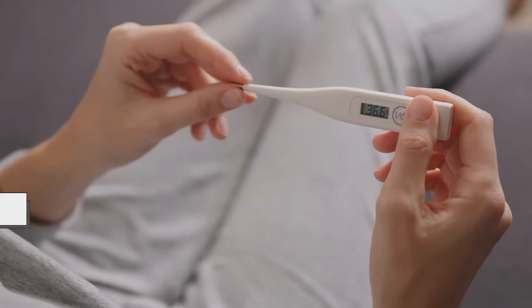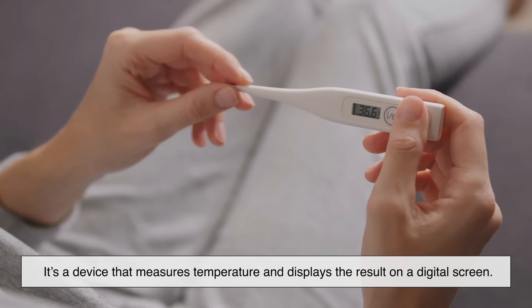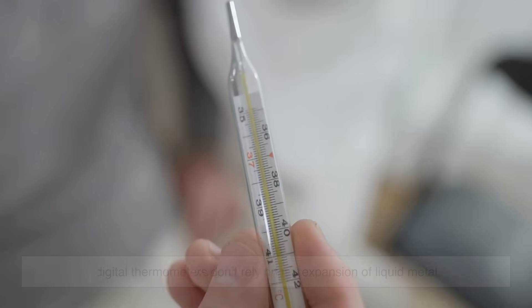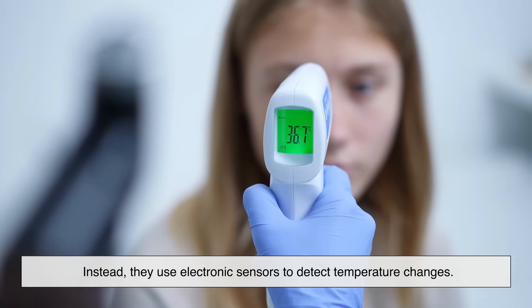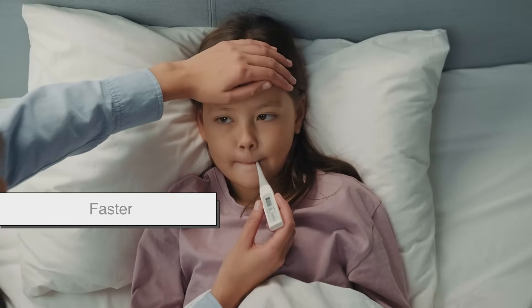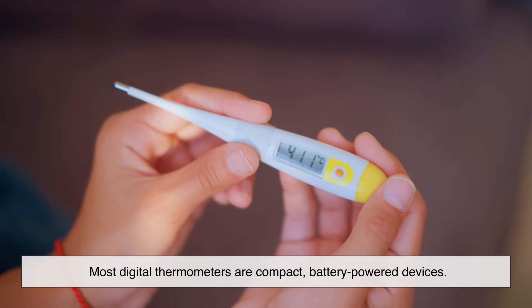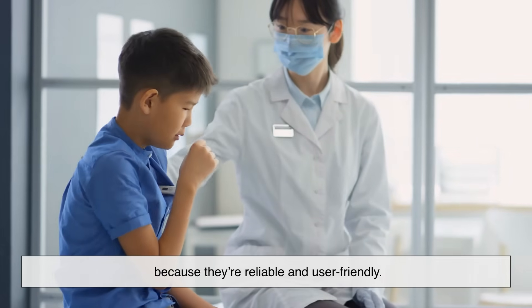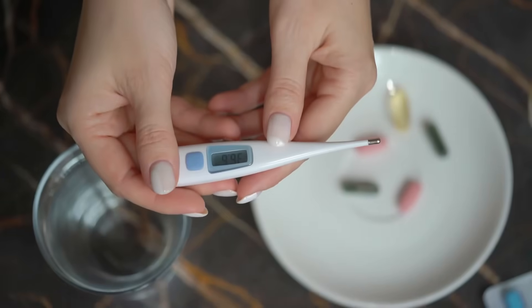First things first, what is a digital thermometer? Simply put, it's a device that measures temperature and displays the result on a digital screen. Unlike old-school mercury thermometers, digital thermometers don't rely on the expansion of liquid metal. Instead, they use electronic sensors to detect temperature changes. This makes them safer, faster, and much easier to read. Most digital thermometers are compact, battery-powered devices found in homes, hospitals, and clinics because they're reliable and user-friendly. But what makes them tick? To understand that, we need to take a peek inside.